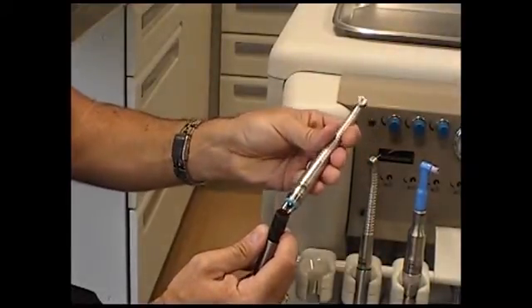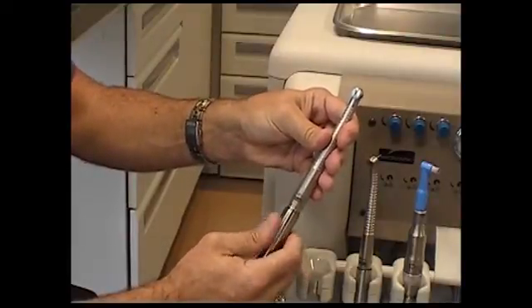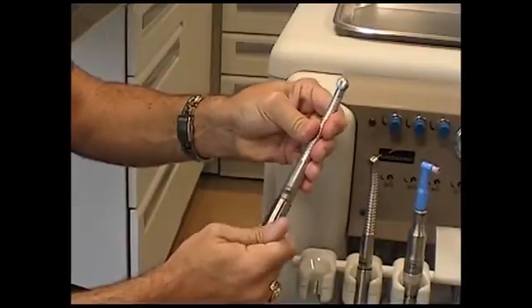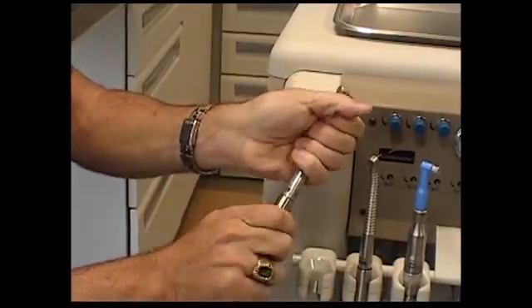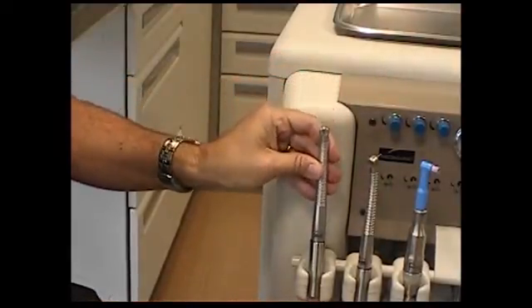First, let's start with the high-speed handpiece located on the far left or first position. We install the handpiece by removing the high-speed handpiece head from the box, lining it up with the hose and securing it to the coupler. Make sure the silver sleeve on the hose covers up the connection.